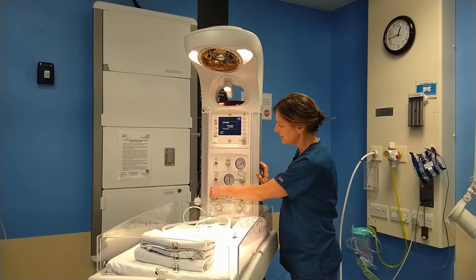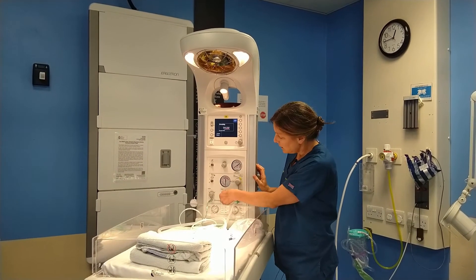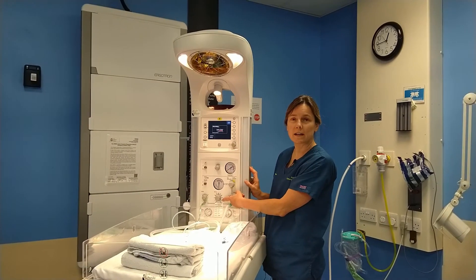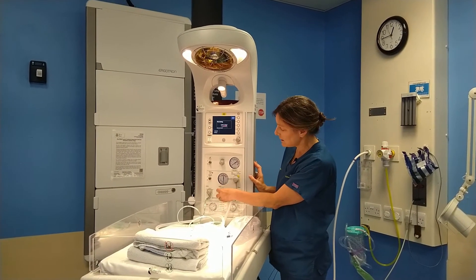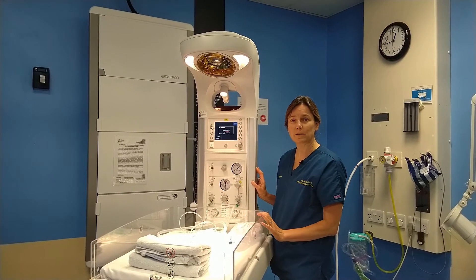In the centre is a dial that allows you to mix oxygen and air. We usually start off ventilating at 100% oxygen, and then as things progress and the SATs are achieved you can dial the oxygen back to the amount that you'd want.